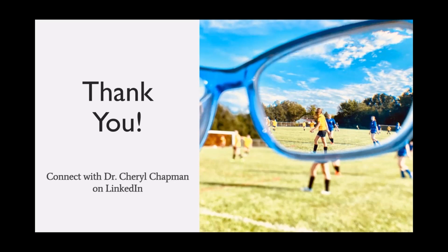There have been instances where I will see some central SPK after the first night of wear, and that's the only time I ever see it. It's just because it was such an abrupt change to the cornea, and that lens was sitting a little closer than maybe it should have for that first night. But after that first night, the cornea has changed enough that it's not really an issue anymore.